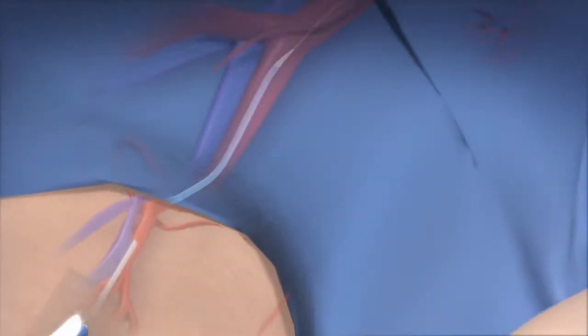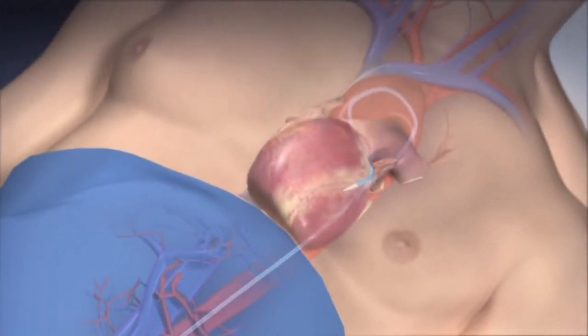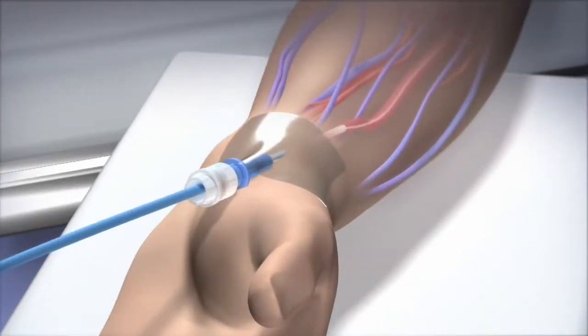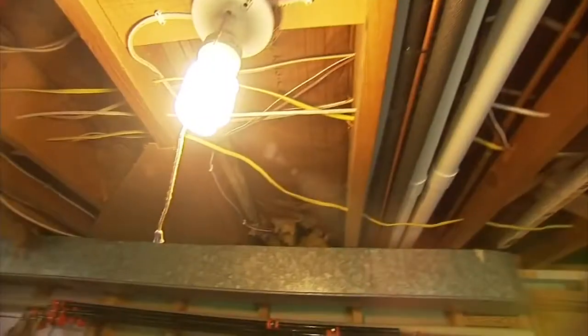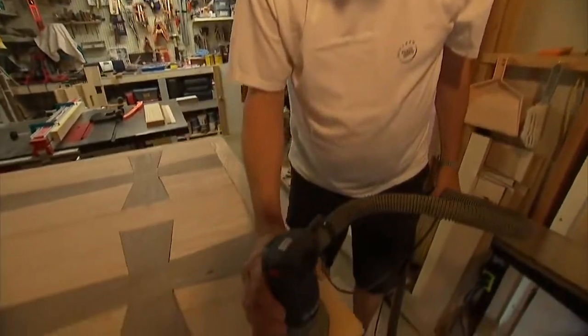For the traditional method, doctors place the catheter into the femoral artery and run it up to the heart. For the other method, doctors start at the radial artery in the wrist and thread the catheter to the heart. Same access to arteries, but fewer risks. Greg says if he ever has to have another stent, he's going to opt for the wrist procedure. I know the difference.